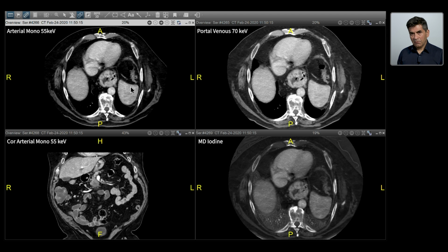But also, there might be incidental findings that we might have to both detect and characterize, because the ramifications for managing pancreatic lesions are huge. So, being accurate in our assessment is critical. More importantly, the referring physicians rely heavily on the report we provide from CT images in making a decision on patient management. I also want to emphasize that CT is the modality of choice in the assessment of the pancreas.